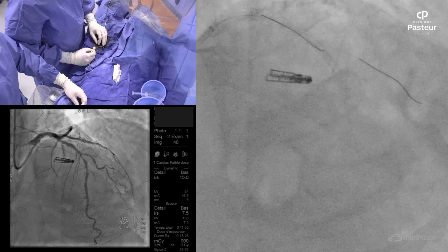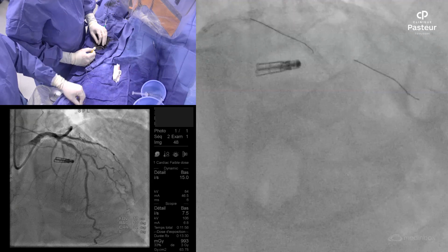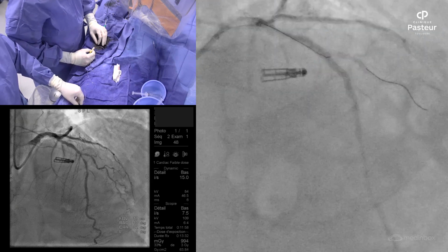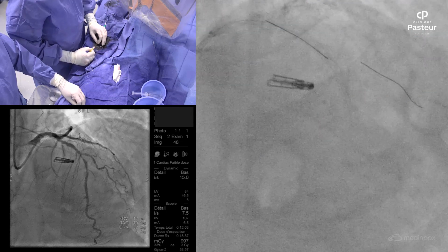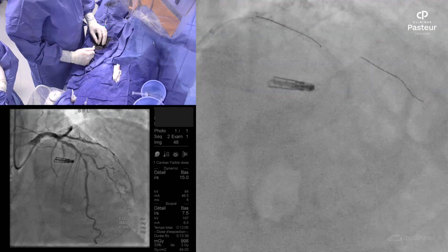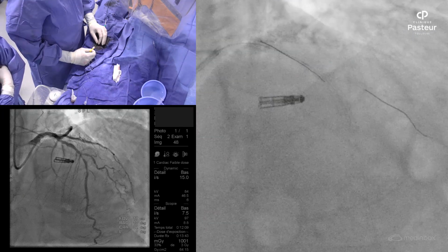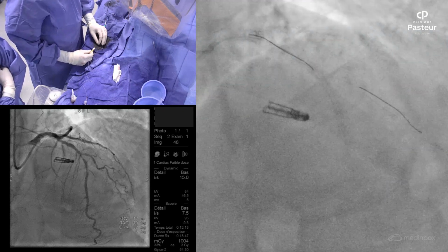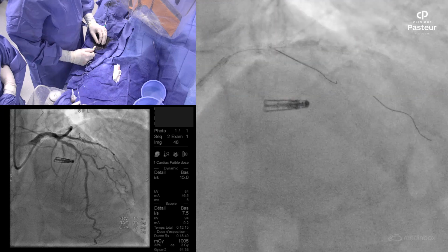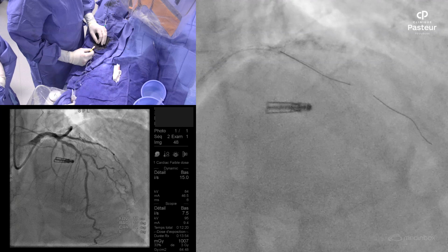As we go for a T provisional, we have to go on the distal strut of the bifurcation. But, I am a little bit provocative, it might be that you don't need to recross and dilate, because the result might be already quite good like this for an 84 years old man. If you take two projections and you like it, you don't need to recross. I think it's not provocative, it should be a wise solution.